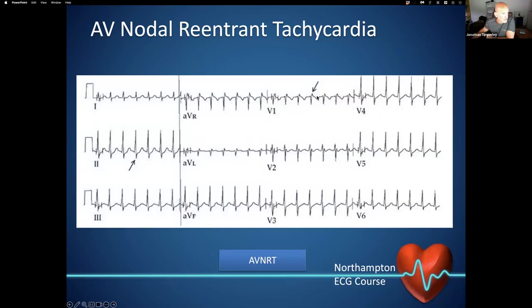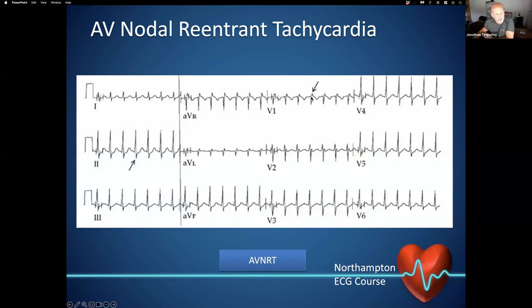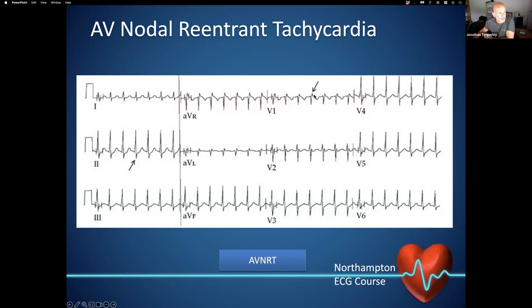Here's another example showing a simulated R wave at the tail of the QRS. This can make you think it's an incomplete right bundle branch block, but actually you should consider whether it could be a simulated R wave relating to the P wave from retrograde conduction during an AVNRT.